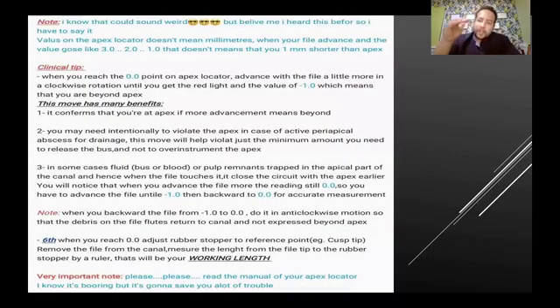Now, when you approach the apex and the number decreases and the bars increase until it reaches 0.0, you will find 3.0, then 2.0, 1.0, and then 0.0, and then it will turn red to minus 1.0. Some clinicians, when they reach 3.0, think that there are 3 millimeters until the apex. This number doesn't mean millimeters. When you insert the file into the orifice of the canal, you will find 70 or 23 or whatever. This doesn't mean millimeters.